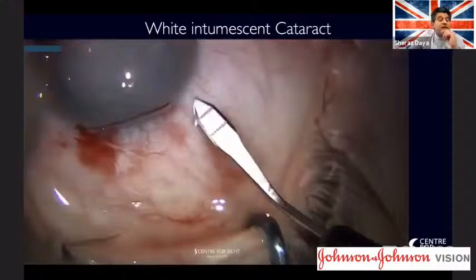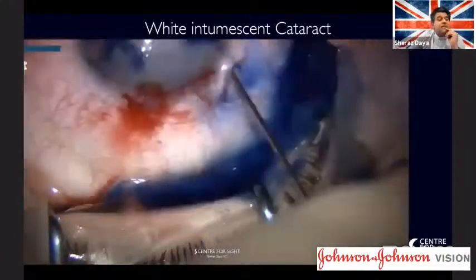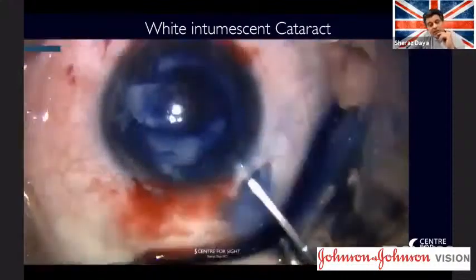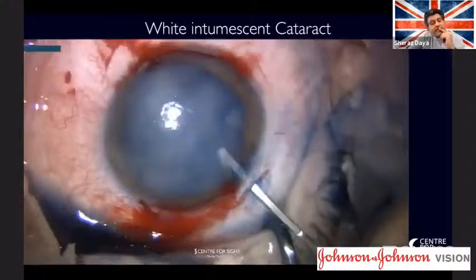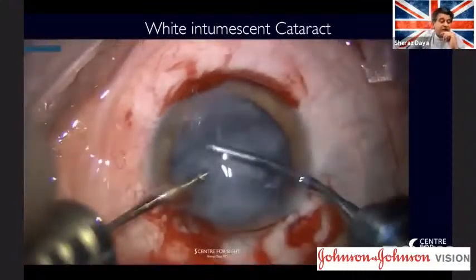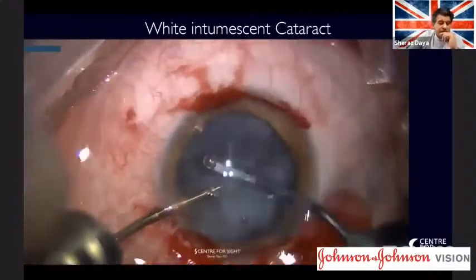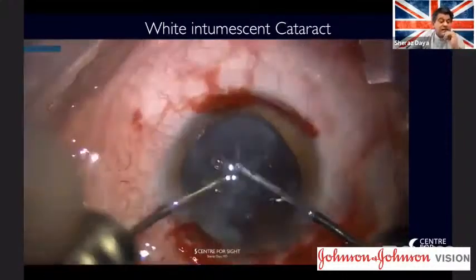And I've got this cloud of material inside the eye. So I better put some trypan blue in while I've got the option, not sure it's going to do much with all that material in the eye. And then I drained out all that liquid and cortical material. I realized he actually had an anterior plaque there as well. And I had a superior opening from the femto. So yeah, I'm just aspirating. As I said, he was a young guy. And I just irrigated, aspirated his cataract.